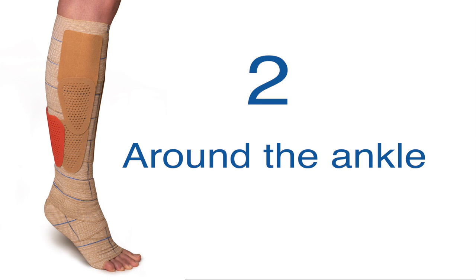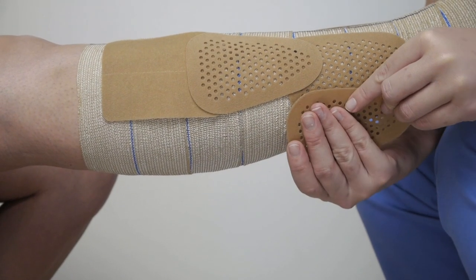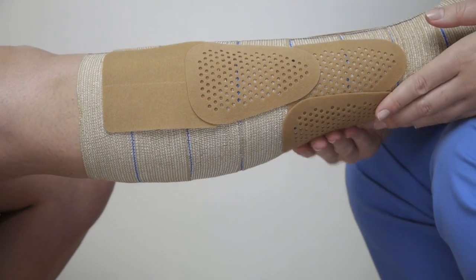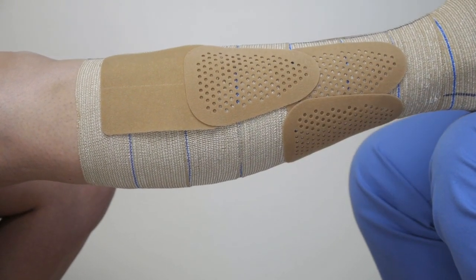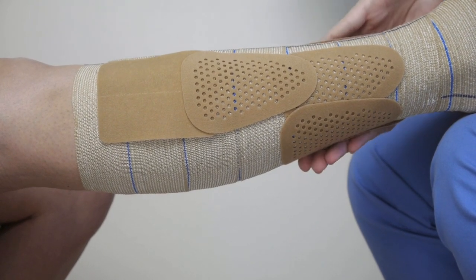Now place the patches around the ankle. Place the patches above the ankle with the narrow end of the press patch pointing downwards. This will create a better transition from the constant pressure of the bandage and the higher working pressure of the patches.